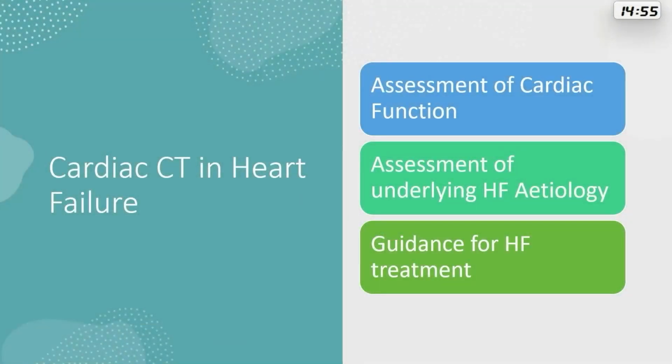My talk is about the role of cardiac CT in heart failure. Basically, cardiac CT can be used in heart failure for assessment of cardiac function. It can be used for assessment of the underlying cause of heart failure, and it can also be used as a guidance for the treatment of heart failure.